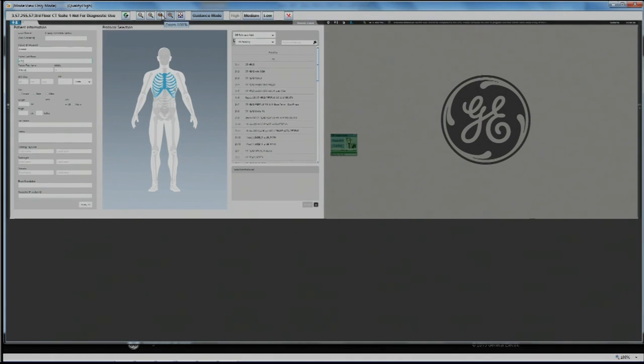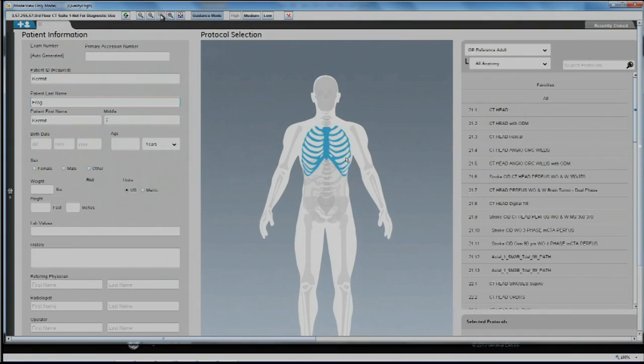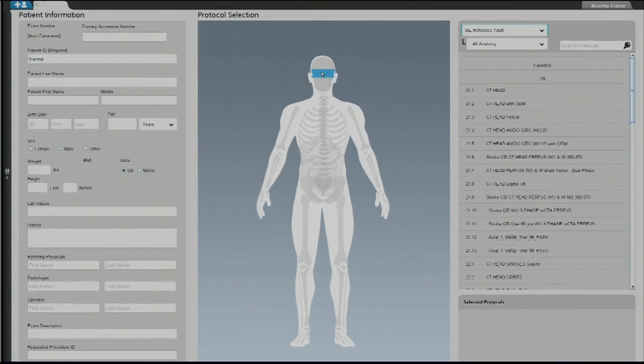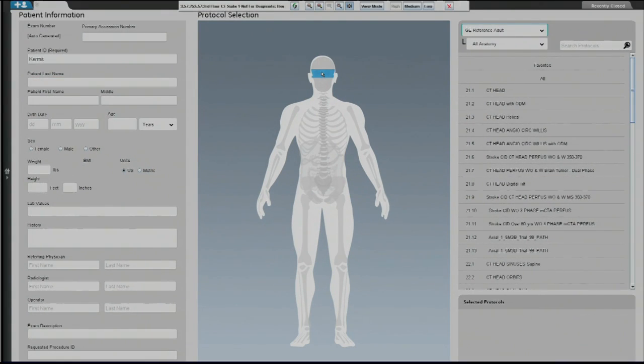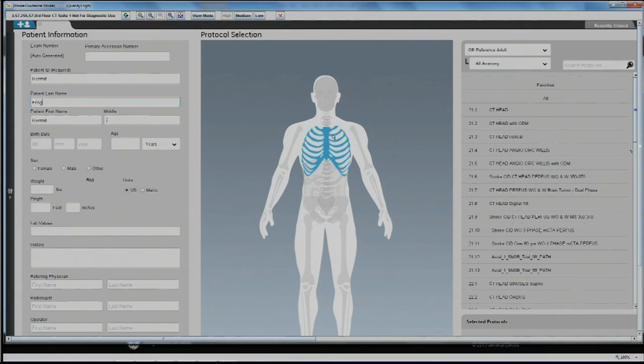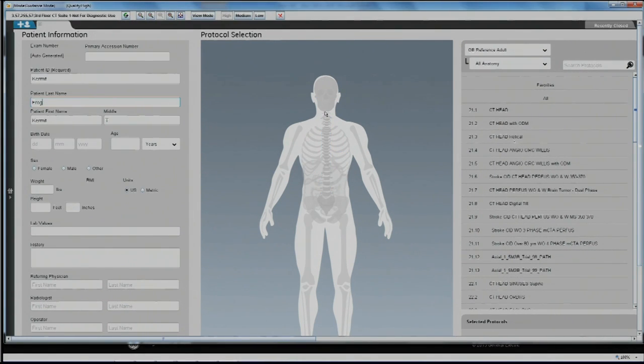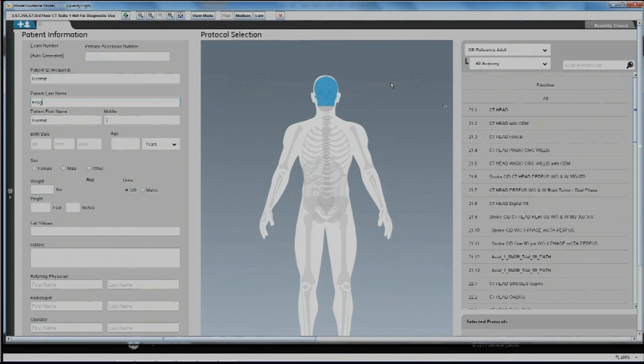Zoom the viewer to take up the entire browser window, put the viewer into full screen mode, and switch between guidance mode, where you can interact with the imaging device, and view only mode, where you can simply watch what is happening on the device.